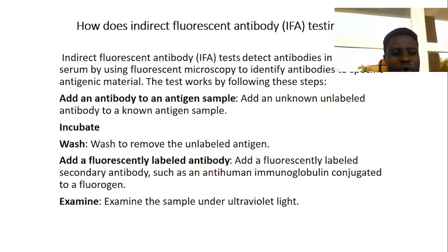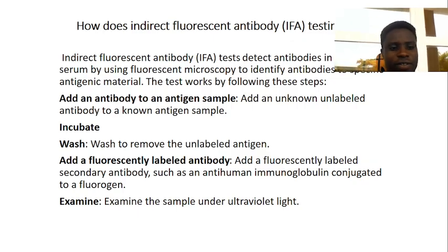Secondly, incubate the mixture of antigen and antibody at 37 degrees Celsius, which is the optimum temperature for the antigen-antibody reaction, as the body temperature is 37.